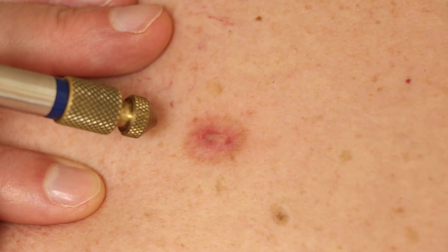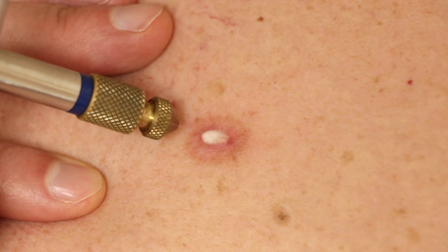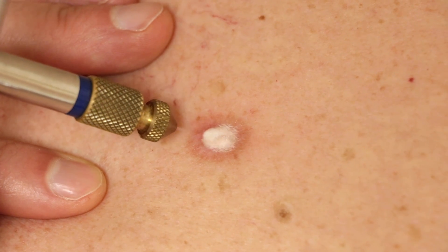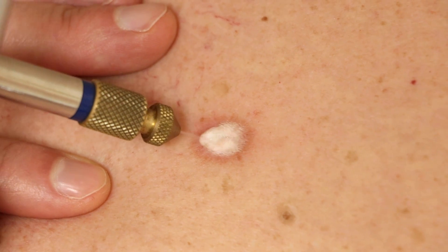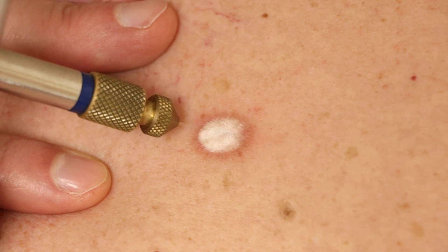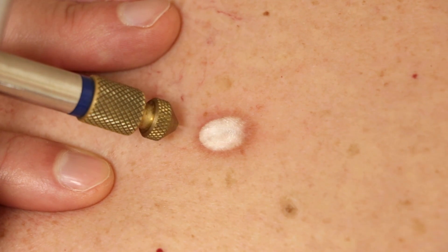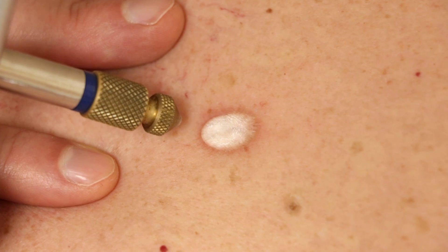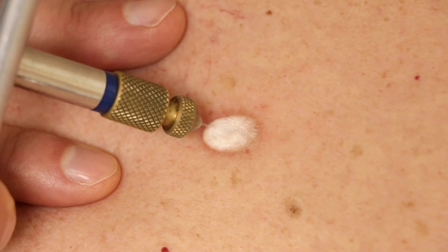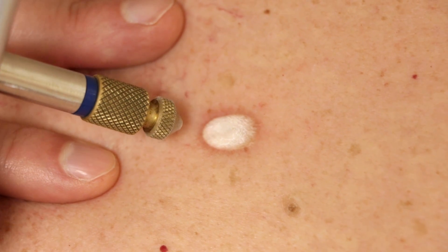We're going to do it again. We'll have to give this time to heal before we can judge whether it worked or not — it'll take months. So I figure we'll just do the three-month recheck.